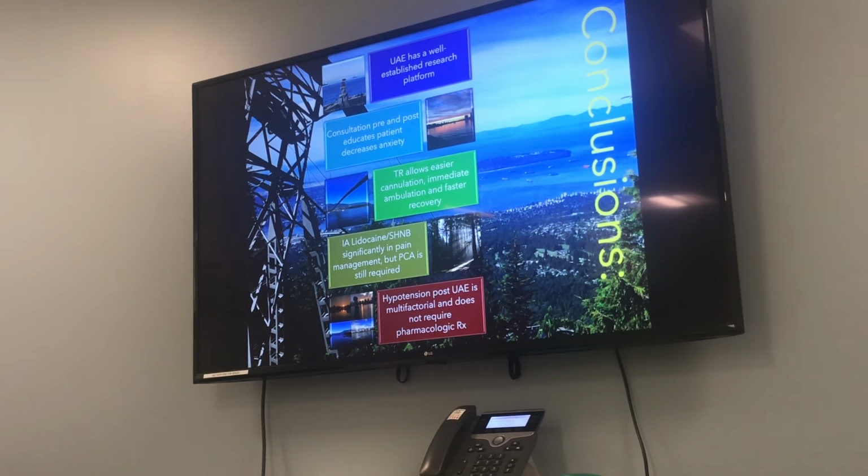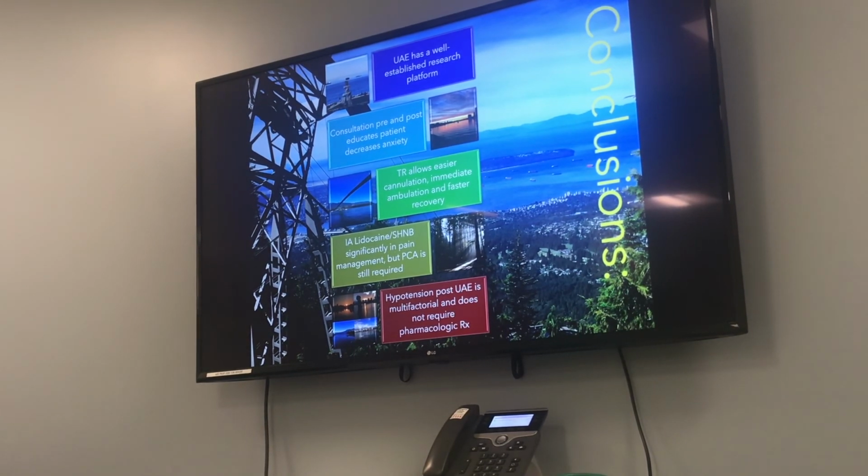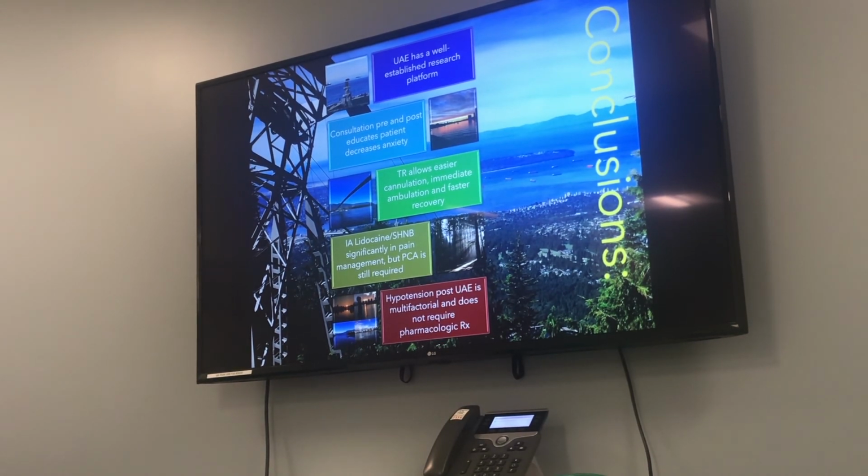If the patient has a pulse, the vascularity is intact, because the thumb and the index finger are the only two fingers in the hand that derive a sole blood supply from the radial artery. So if there's a problem with the radial, the pulse ox will be a problem. So there's your vascular assessment immediately, without you actually physically feeling for a pulse. From a neurological perspective, it's extremely rare, if not impossible, for them to develop a neurological complication in the hand. If they can't grip, it's often because it's a little bit uncomfortable and painful. So grip strength is not a good assessment of neurological status.